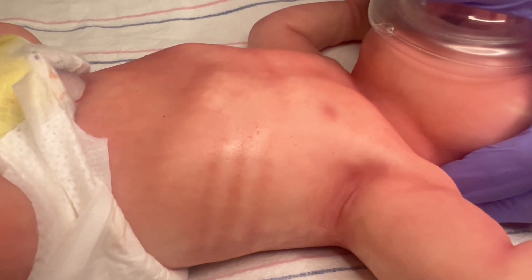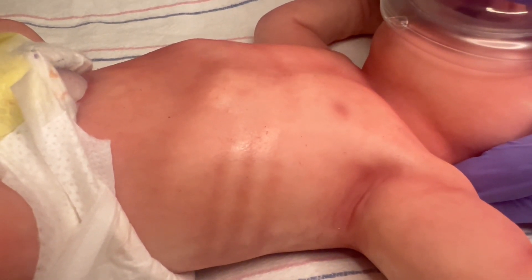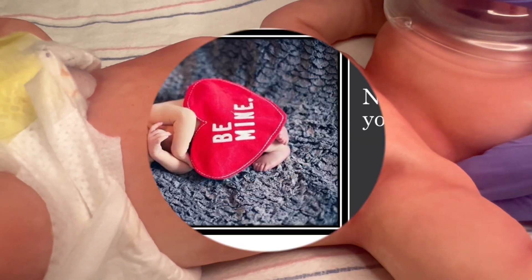Once you feel the airway is cleared, it's time to repeat MR. SOPA, looking for chest rise, increase in heart rate, and increase in saturations.